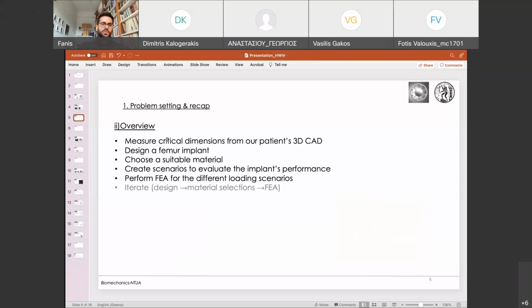So just to go over the steps, the first step is we will need to measure, from the 3D model generated in the previous step, some critical dimensions in order to know what the patient's bone is like, what the critical dimensions are, and how the implant will fit. In the second part, we will use these dimensions to design a femur implant. We will design a rather simplistic femur implant, not a very detailed one.